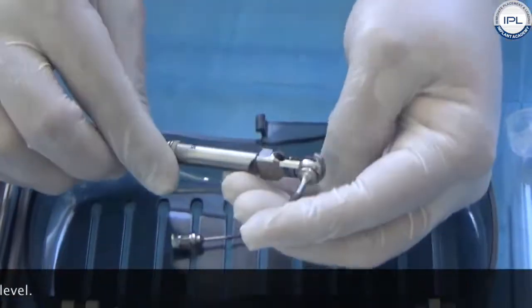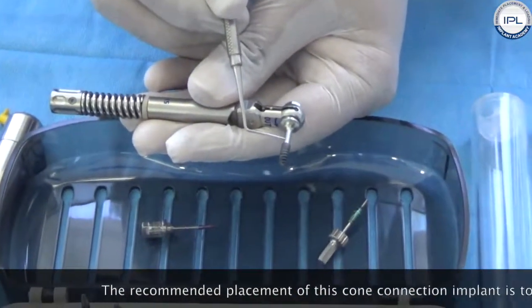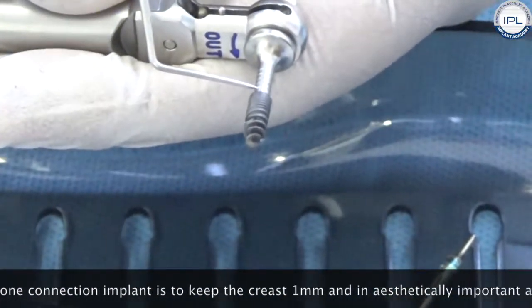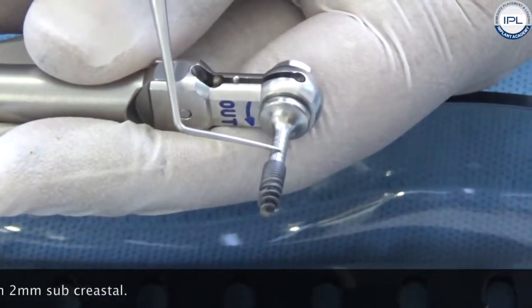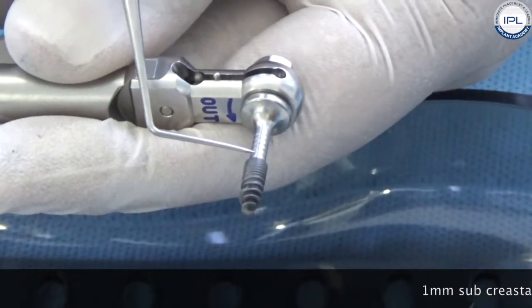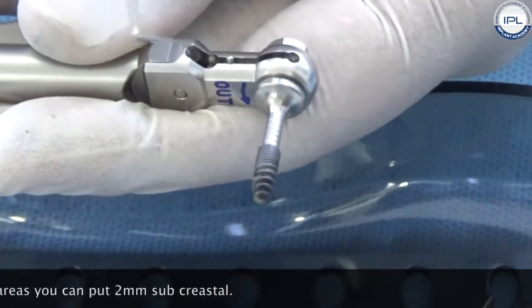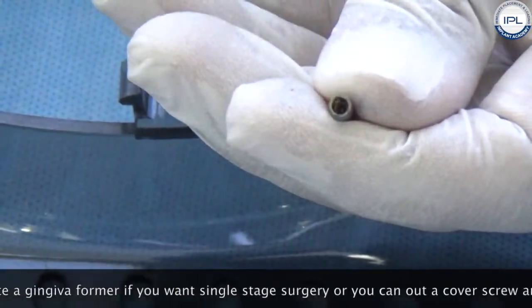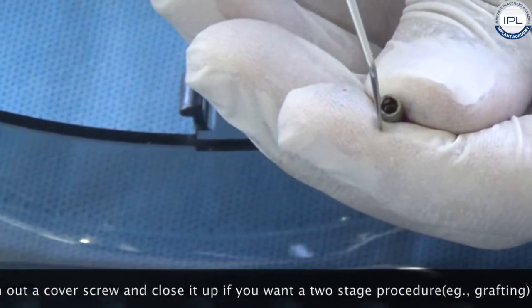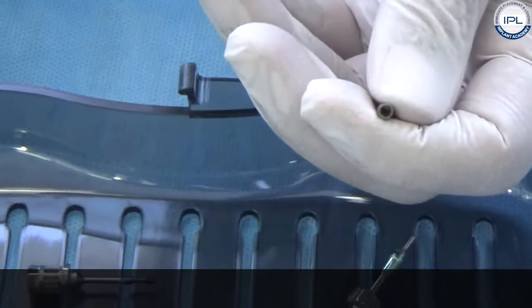The recommended placement for this cone connection implant is to keep the crest one millimeter subcrestal. In aesthetically important areas, you can place it even two millimeters subcrestal — there are markings on the implant indicating one and two millimeters subcrestal. After placement, you can go ahead and place a gingival form directly if you want a single-stage surgery, or place a cover screw and close it up for a two-stage procedure, such as when you are doing grafting.